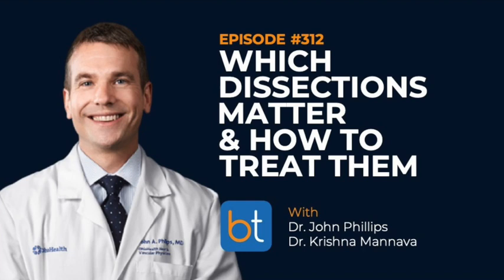Yeah. Well, let's jump into the meat of it today. We wanted to talk a little bit about which dissections matter with respect to peripheral arterial disease in the leg, whether it be above the knee, below the knee, or both. John, can you just tell us a little bit about when you are most commonly seeing dissections when you're treating PAD? Well, honestly, anytime you inflate a balloon in an artery, you're creating some type of dissection. Now, whether or not it's quote unquote flow limiting remains to be seen. Oftentimes, at least for me, I try to think about the dissection in a couple of different ways. The biggest one is, is flow being limited?